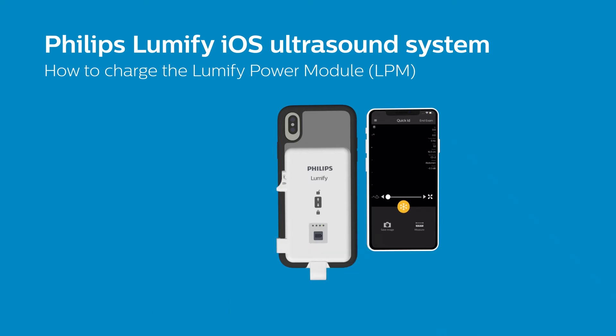You can check the charge level of your LPM at any time by pressing the battery icon button to illuminate the LED indicators.